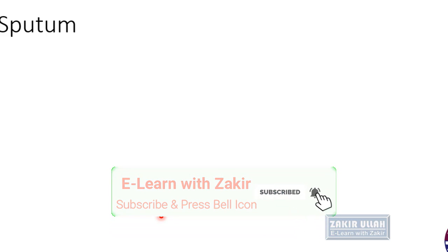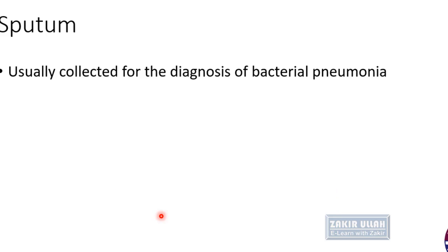Coming to the sputum, the sputum is usually collected for the diagnosis of bacterial pneumonia and also lower respiratory tract infections.